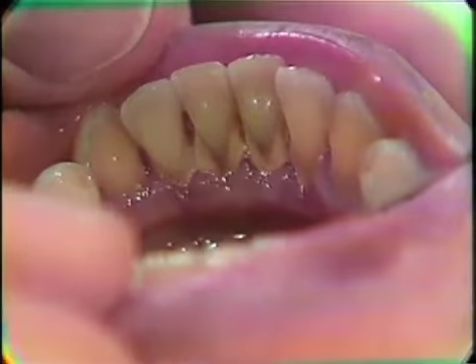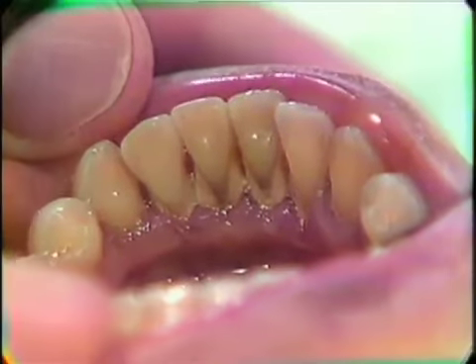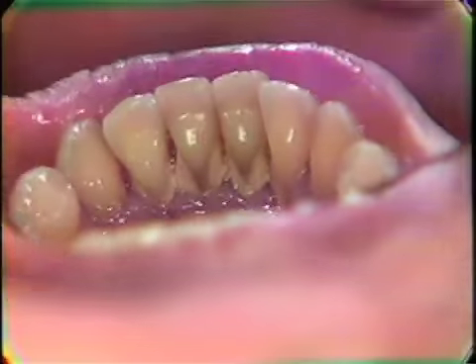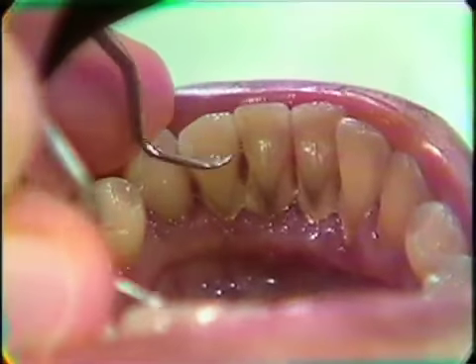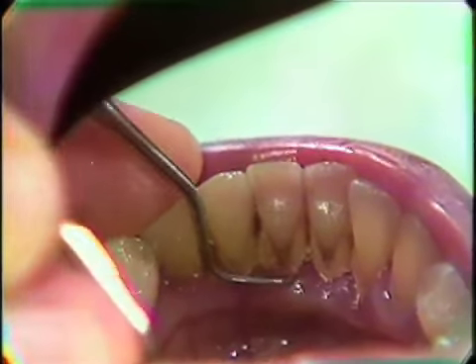You notice here we have a heavy bridge of calculus on the lingual of these lower anterior teeth, and the calculus tends to obscure the cementum enamel junction. Can you turn your head just a little bit like this, please? That's fine. In order to make a viable recording here, we would have to go in here and remove some of the calculus from that root surface.